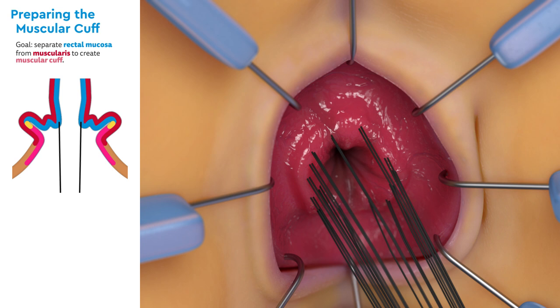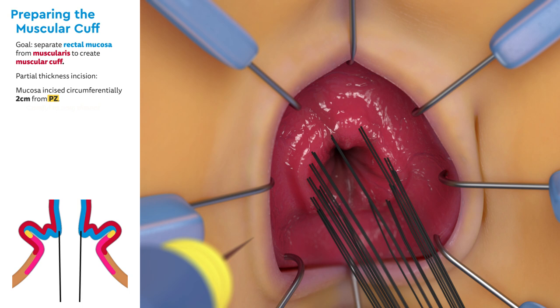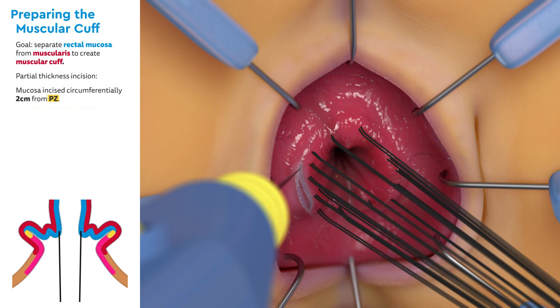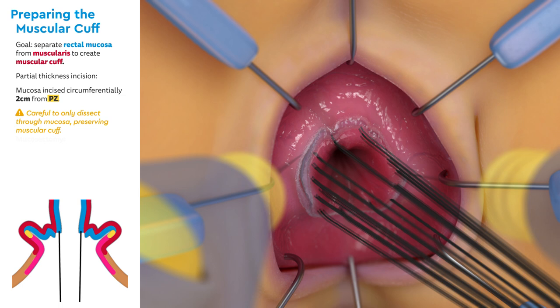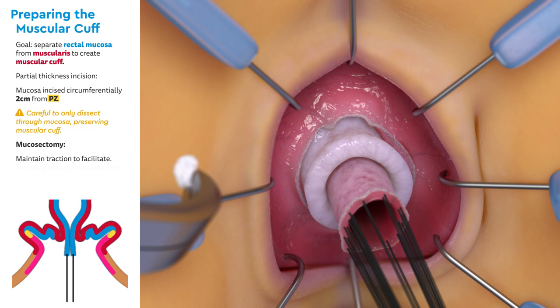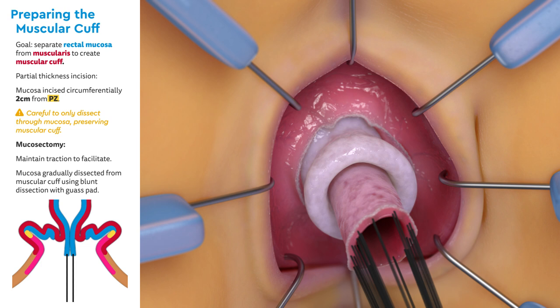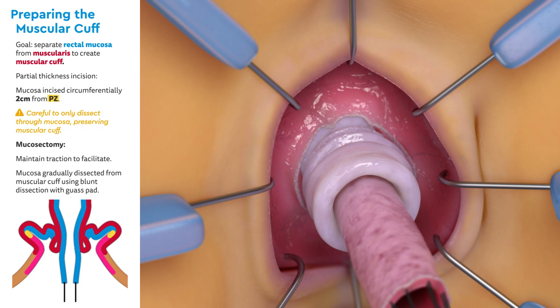Next, the muscular cuff will be created. The goal is to separate the rectal mucosa from the muscularis to create the muscular cuff. First, a partial thickness incision is made. The mucosa is incised circumferentially two centimeters from the pectinate zone, distal to the traction sutures. Care is taken to only dissect through the mucosa and not into the muscular layer to preserve the cuff. Firm and continuous traction of the sutures is used to expose the mucosa and facilitate the mucosectomy. The mucosa is gradually dissected from the muscular cuff using blunt dissection with a gauze pad. Note that blunt dissection must be used for the duration of the mucosectomy; this process has been sped up in this demonstration.